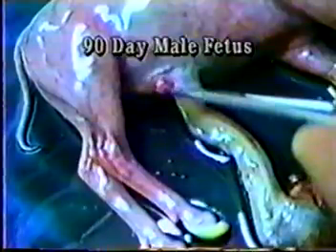This 90-day male fetus in lateral recumbency shows the already developing preputial area just behind the umbilicus. The dome shape of the cranium again is an important landmark for anatomical reference. Note the lack of a genital bud under the tail. An ultrasonographer should consider that only as supportive evidence in fetal sex determination.